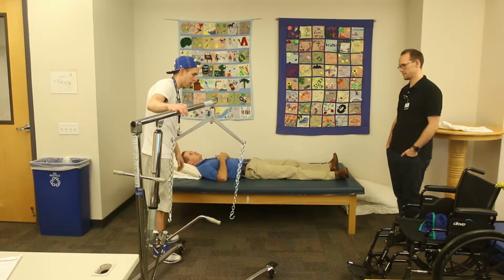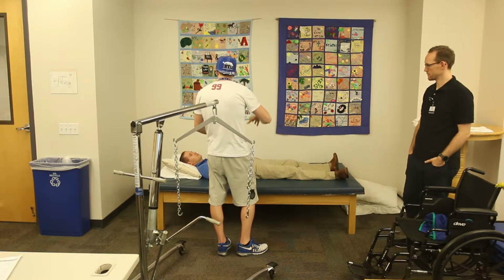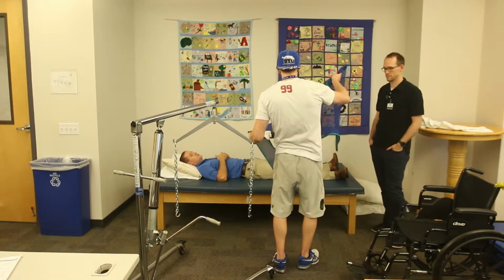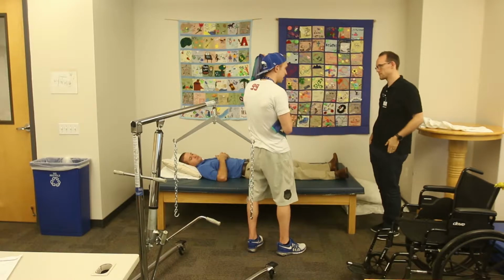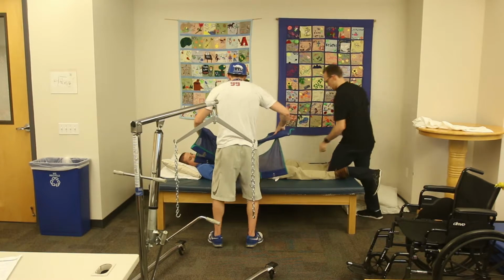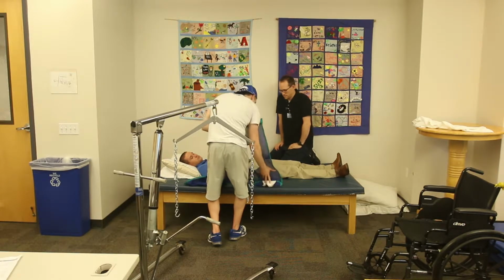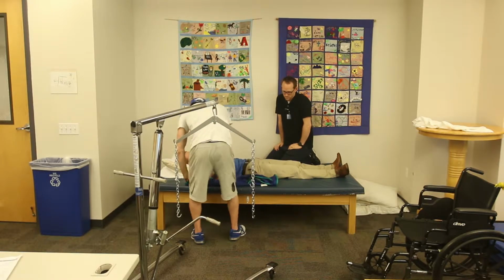Sounds good. Okay. Very first thing that we're going to want to do is we're going to put a harness underneath you that our lift will pick you up with. Okay. So we'll get this situated first. So this is going to go down. He's going to sit right in this hole. So that's kind of where we want to be positioning it. So Lucas is going to come around onto this side and he's going to help out. First things first, we want to make sure that this has the seams down when we're putting you on top of it, so that way you're not on top of the uncomfortable seams.